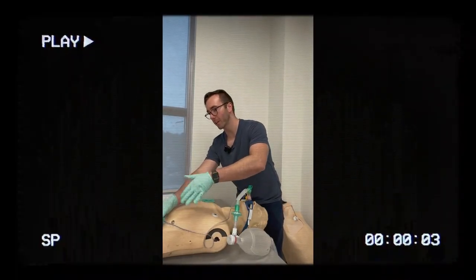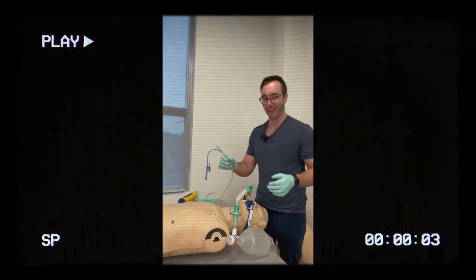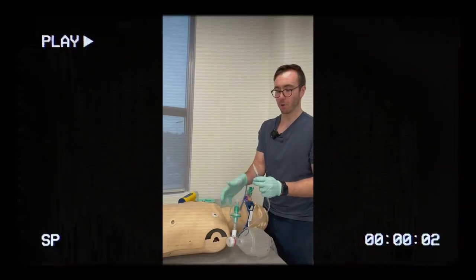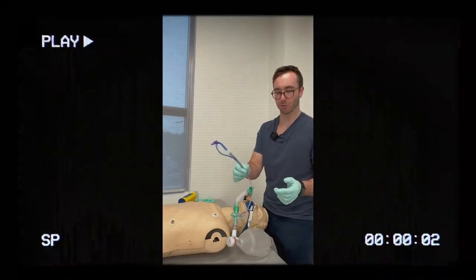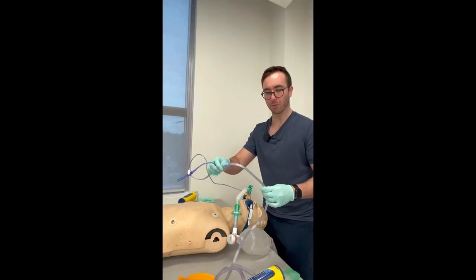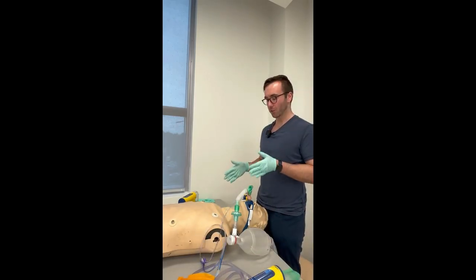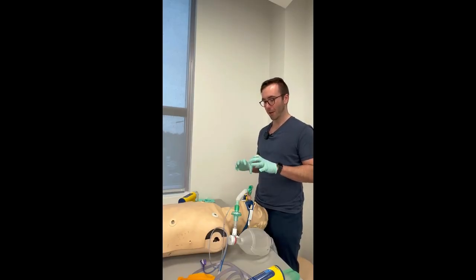If you're extricating a patient and this tubing becomes lower than the patient, gastric secretions can pour out of it if it is in the stomach. If the tubing gets lowered during a call, that can happen. If you're going to extricate the patient, it's recommended to put a cap on the other end to keep it sterile and prevent gastric secretions from spilling. Otherwise, take the other side of the double lumen and connect it to your Yankauer tubing, then turn on suction as needed.